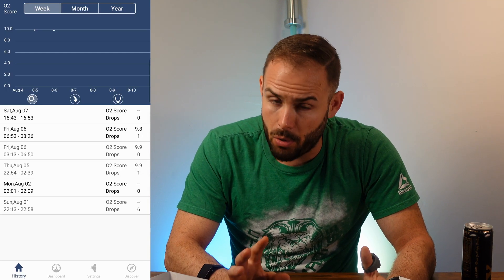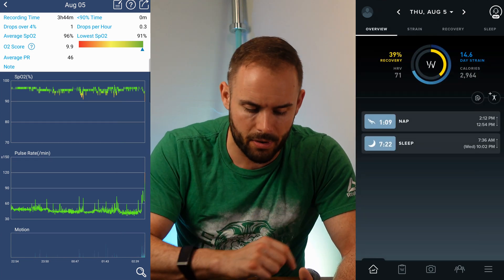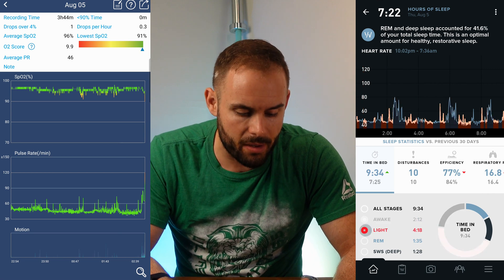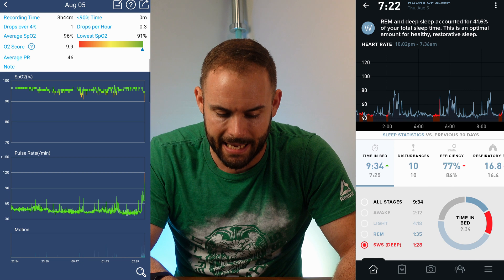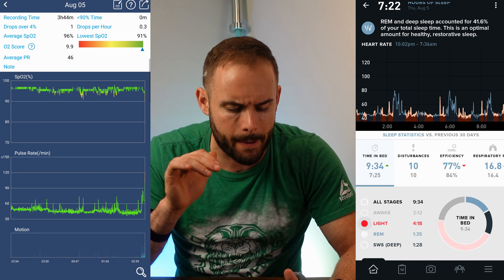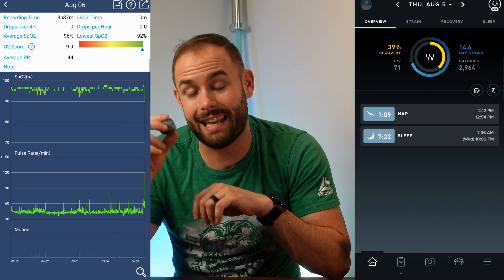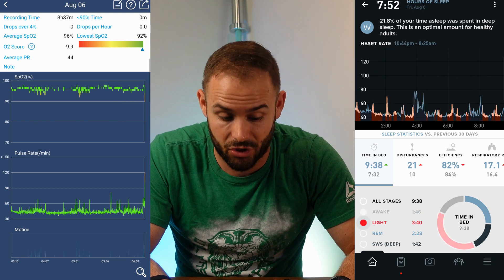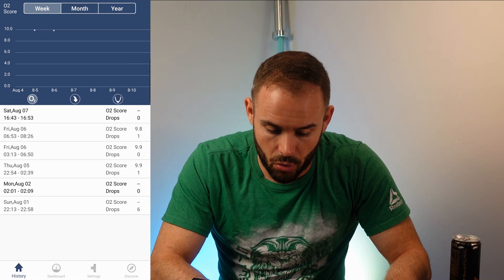The app has all your history. Going into Thursday's sleep, I can see my pulse rate — I'll actually pull up my Whoop for comparison — and my SpO2 score throughout the night. It gives me an O2 score at the top: I was at 9.9, with an average SpO2 of 96%, and drops over 4% — I only had one. One thing I was a little disappointed in: since I'm a new father, I had to take off the ring during the night, and it only gives you 10 seconds before it ends the sleep session. So my Friday session actually turned into two separate sessions because I went back to sleep after feeding my baby.